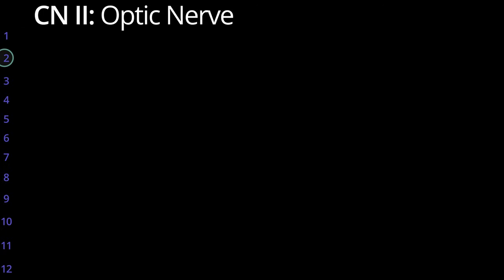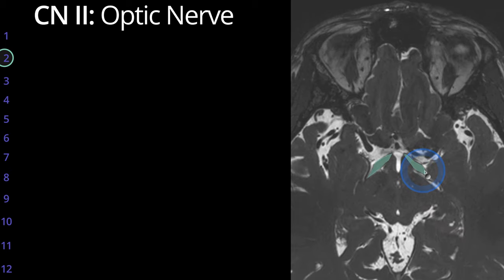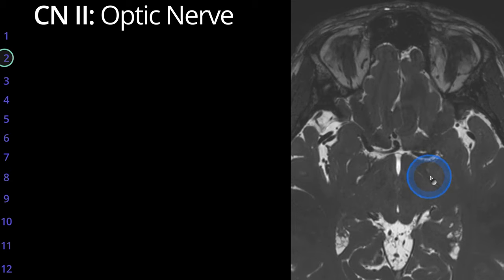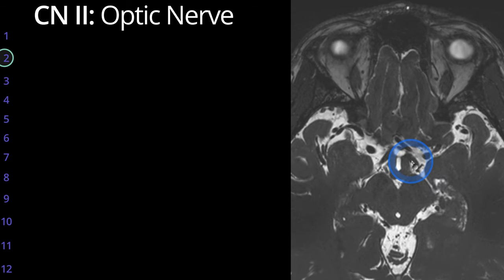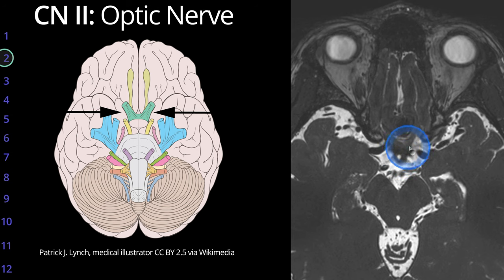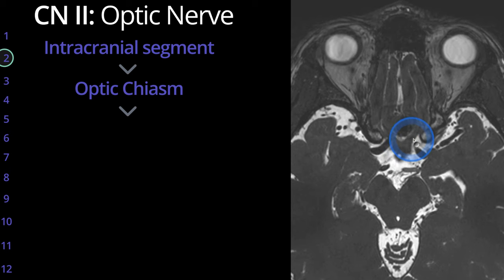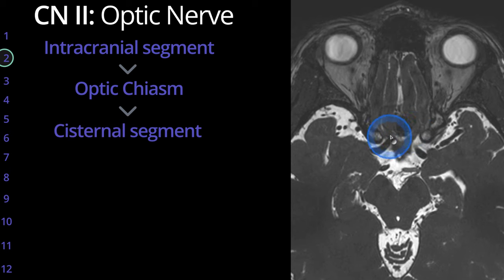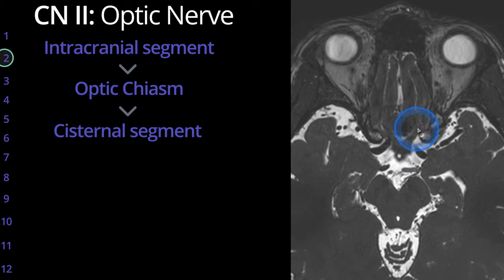Next we go to the second cranial nerve, the optic nerve. We'll start with the optic tracts, which can be seen as hypo-intense or dark structures extending through the CSF on the left and right. These come together to form the optic chiasm, immediately anterior to the inferior aspect of the hypothalamus and the adjacent pituitary stalk or infundibulum. The optic nerves then continue anteriorly as the cisternal segment, surrounded by CSF.